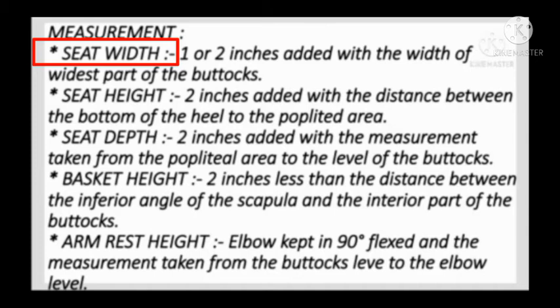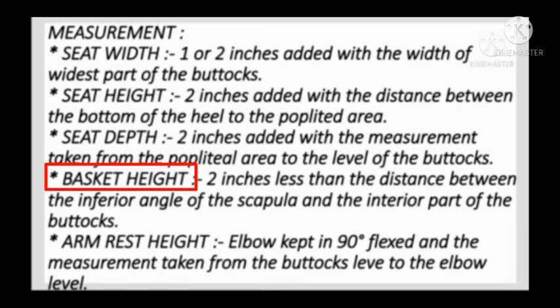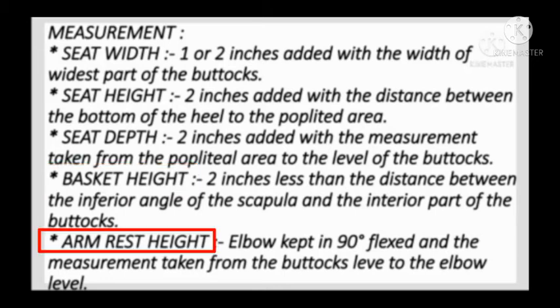Measurement. Seat width: 1 or 2 inches added to the width of the widest part of the buttocks. Seat height: 2 inches added to the distance between the bottom of the heel and the popliteal area. Seat depth: 2 inches added to the measurement taken from the popliteal area to the level of the buttocks. Backrest height: 2 inches less than the distance between the inferior angle of the scapula and the inferior part of the buttocks. Armrest height: the elbow is kept at 90 degrees flexion and the measurement is taken from the buttocks level to the elbow level.